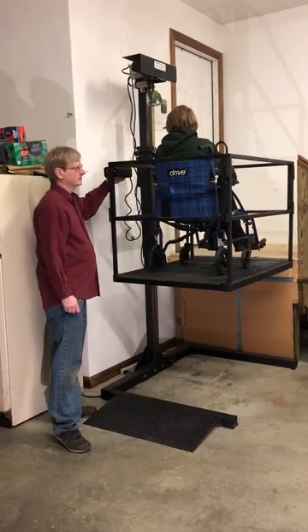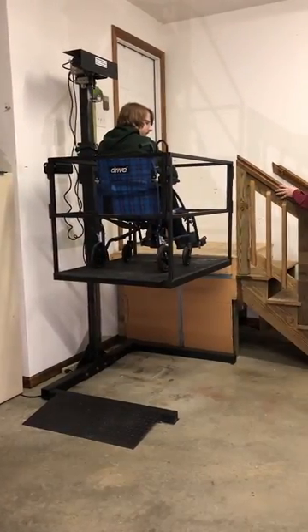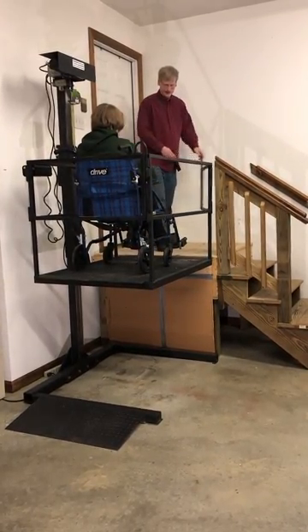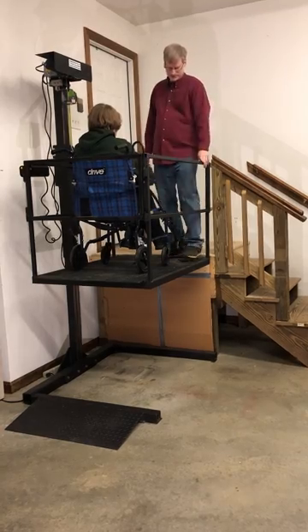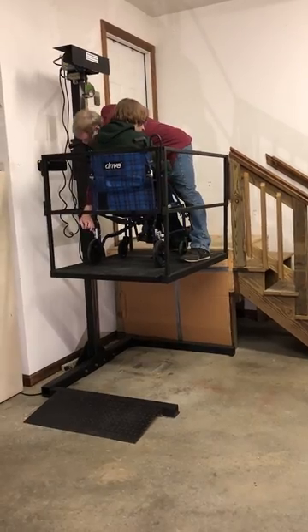This is one way of doing it — you could have stood on the landing or been on the platform just as well. Now you open the gate, reach over, and unlock the wheelchair or the transport chair.